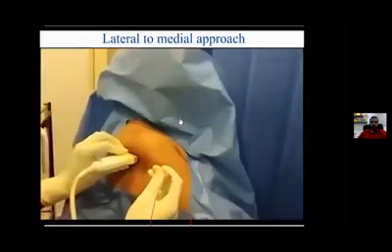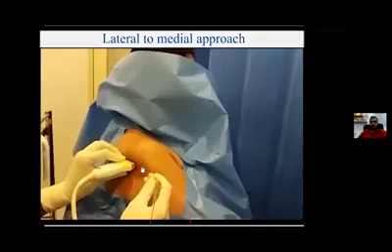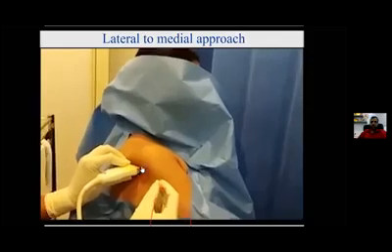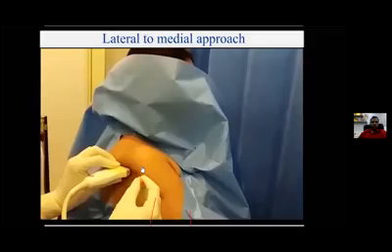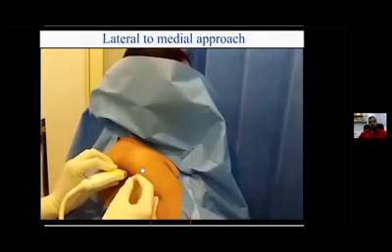Both are okay, but the needle angulation will be a little bit steep, so it will be difficult to visualize the needle. So it is better to use a curvilinear probe in an obese patient. In a thin patient, the linear probe is okay.